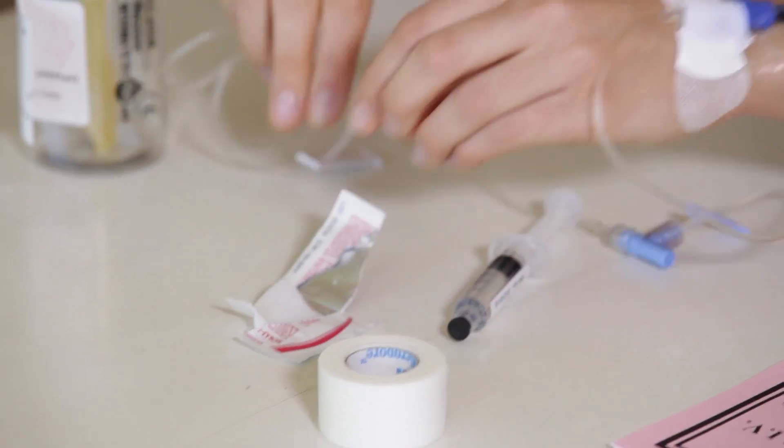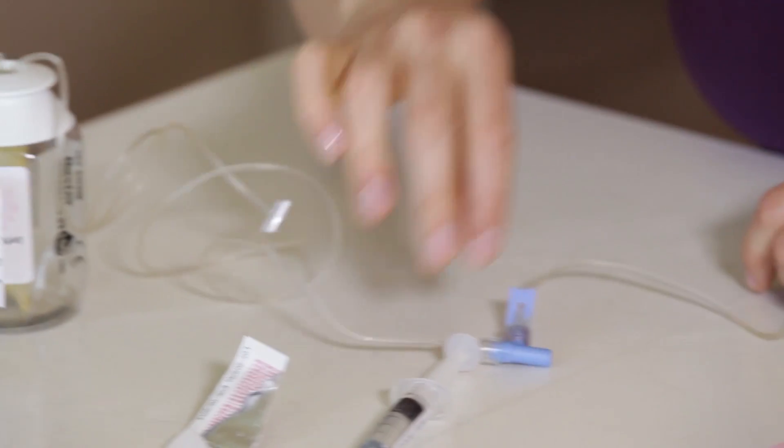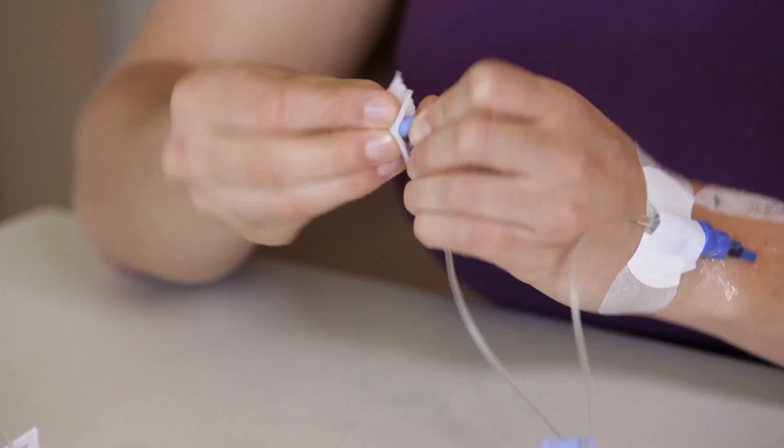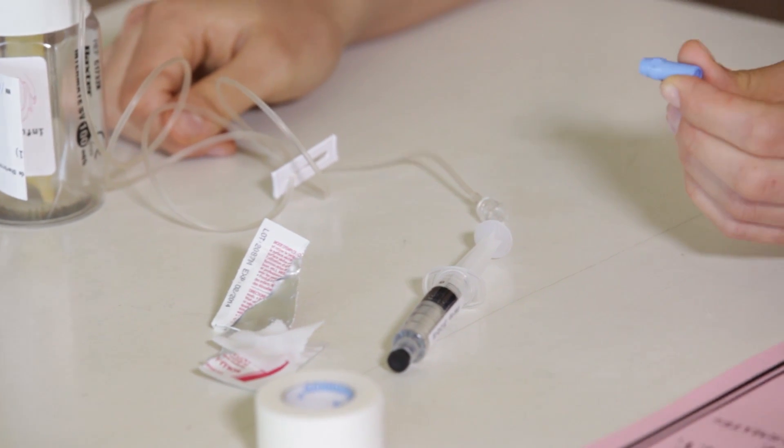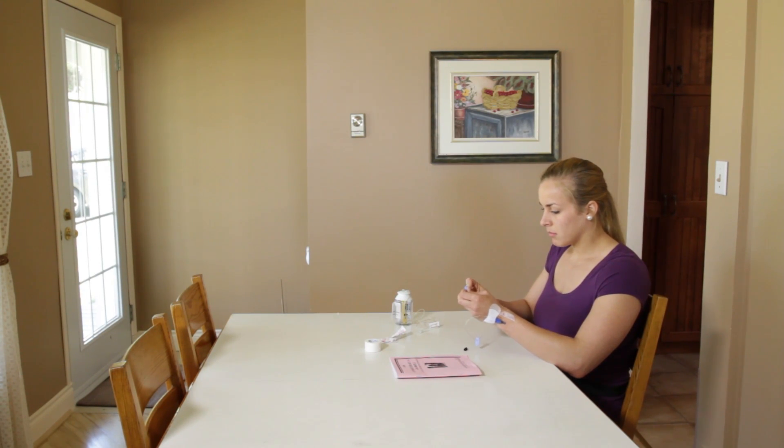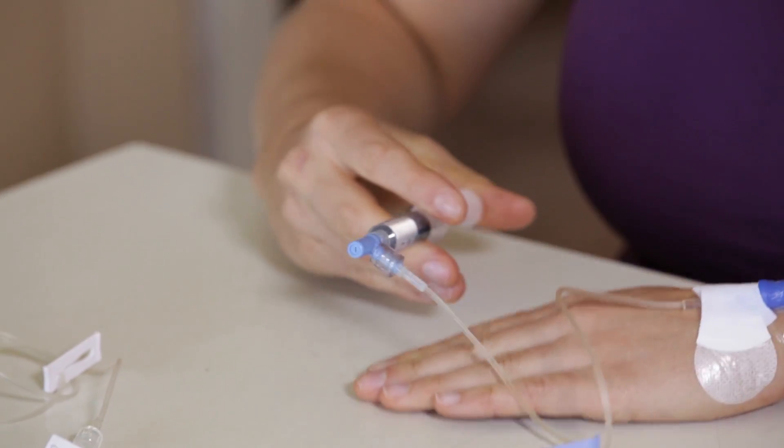Open an alcohol swab. Close the tube clamp on the infuser. Holding the extension tubing from the catheter, unscrew the tubing from the infuser. Using the third alcohol swab, disinfect the tip of the extension tubing and let it dry for 30 seconds. Take the second saline solution syringe, remove its cap, and screw it into the end of the tubing. Slowly inject the saline solution over 15 seconds.